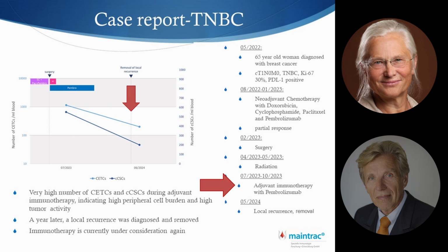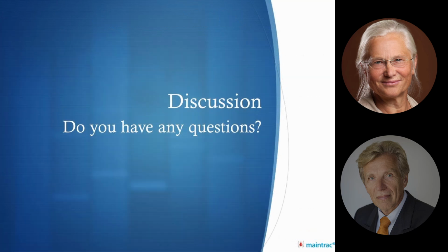She then showed subsequently a local recurrence, which was removed, and we analyzed the cells only after this surgery, and there we could see low numbers in circulating epithelial cells and low numbers in stem cells, but additional immunotherapy is currently under consideration. So after these cases, do you have any questions?